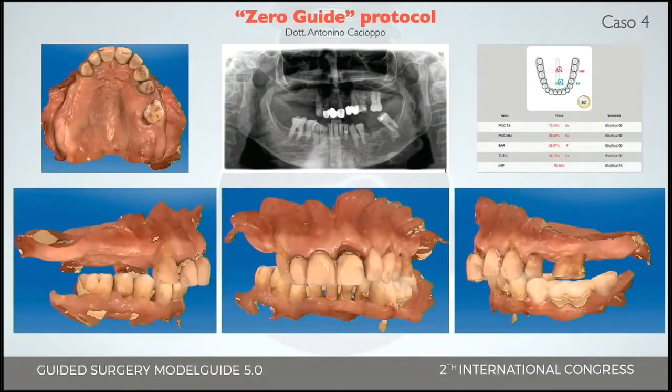But this is one of the two last cases of this webinar. I started this case in my Teethan era. I started with Teethan, and it's not finished at all now. I'm finishing in these days. But look at that.